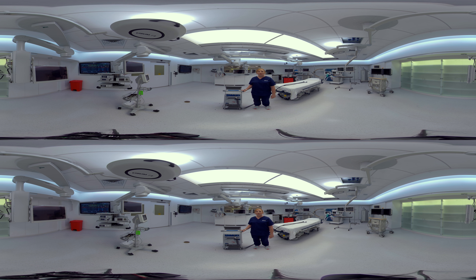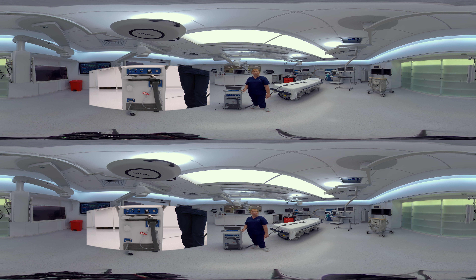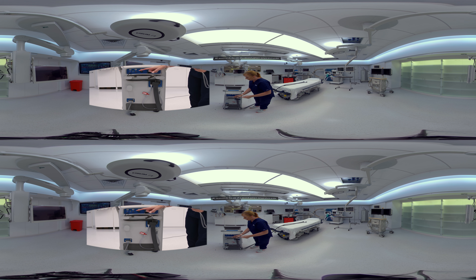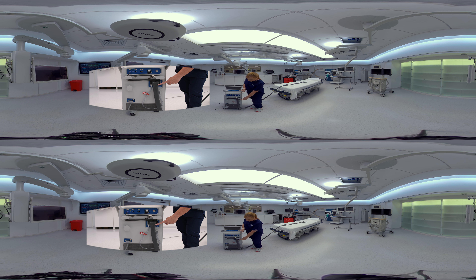Let's go through the features on the back of the Arctic Sun STAT temperature management system. This is the power cable — you must plug it into a power source in order to turn it on, and you can turn it on by flipping the power switch here. This is the temperature cable where you're going to connect your core temperature probe. You may also have a secondary cable here to connect a secondary temperature probe. This is the out cable should your hospital choose to use it. This is the fluid delivery line where you will connect your Arctic gel pads.